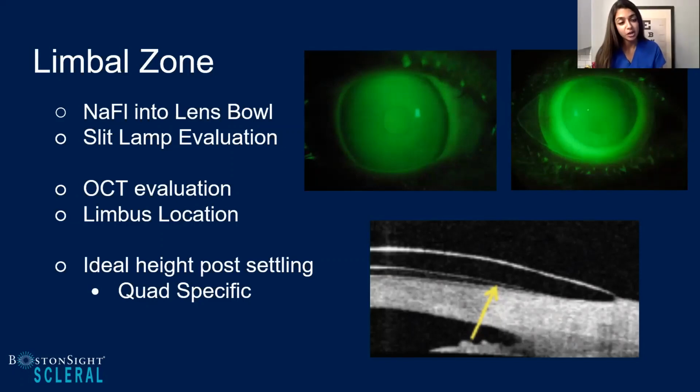I agree. What else is also interesting is we know that gravity plays against us. And so oftentimes scleral lenses, with the way they settle, tend to be inferior temporal. And so really evaluating the limbus in all positions. It's not just superior, temporal, nasal, but also all 360 degrees. And the beauty of the Boston Sight Scleral is that you have quad specific zones that you can really manipulate. And for me, I will sometimes forego slightly higher inferior limbal vault as long as I'm verifying that I'm not doing more harm, just simply because I know gravity is working against me.